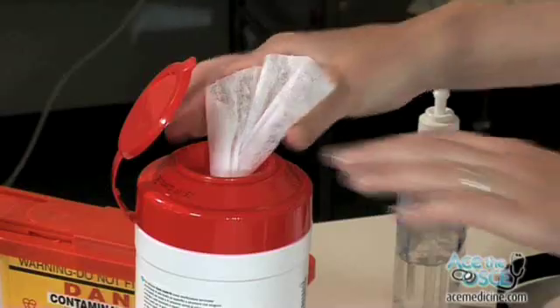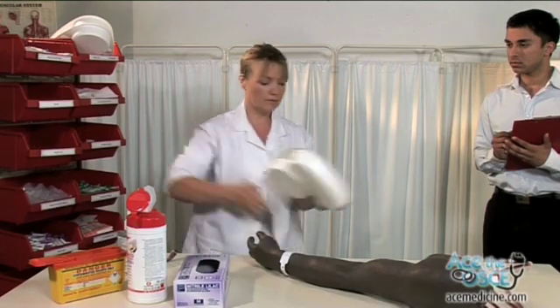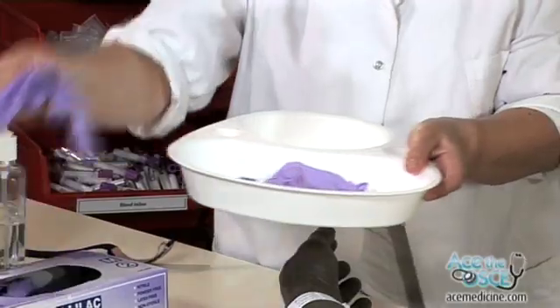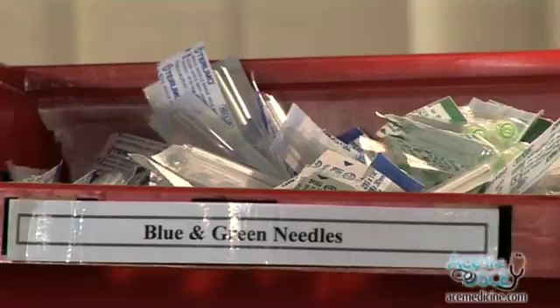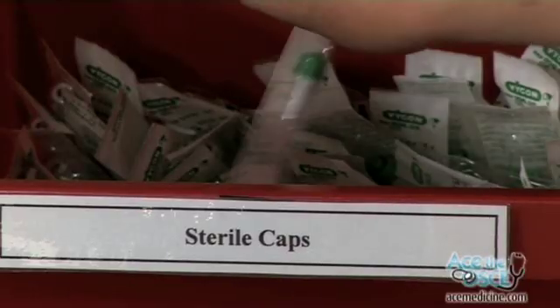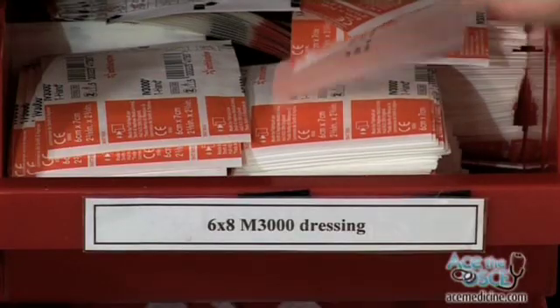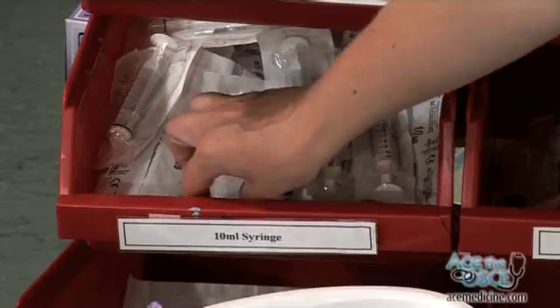Collect a clean tray. Pair of gloves. Tourniquet. Needle. Alcohol swab. Gauze. Sterile cap. Cannula, either pink or green. Cannula dressing. Sodium chloride 0.9% flush. 10ml syringe.